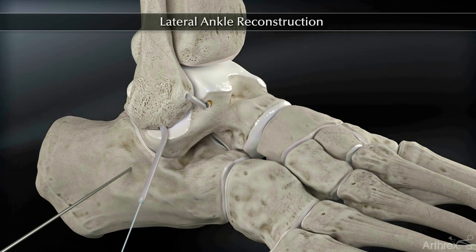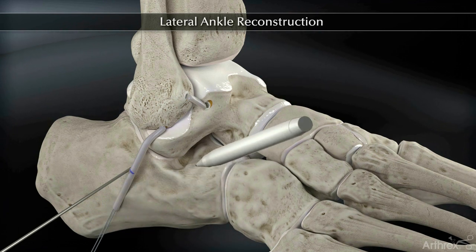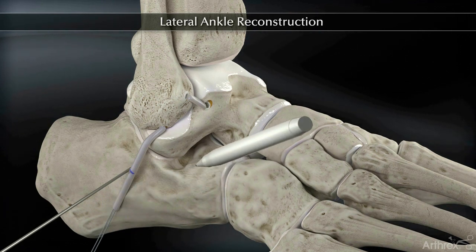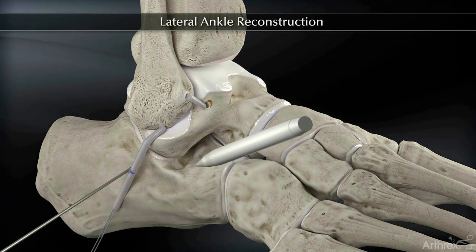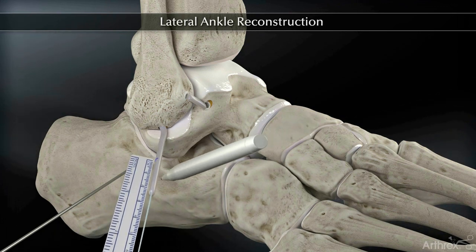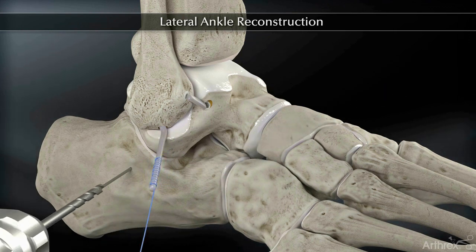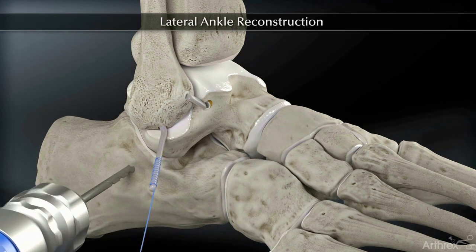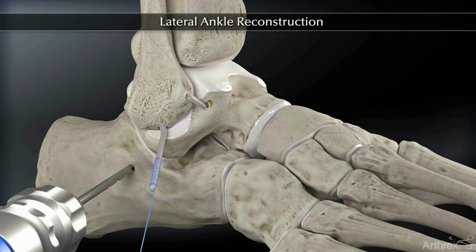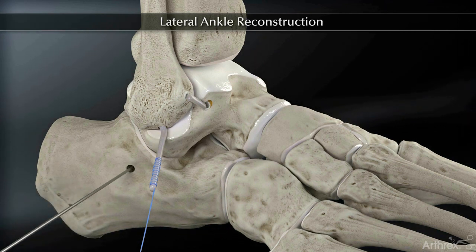Prior to drilling, note the insertion site of the tendon graft into the tunnel and mark the entry point with a marking pen. Measure a distance of 17 mm from the initial line, mark again, and cut any excess tendon. Finally, whip stitch the remaining portion of the tendon. Drill over the 2.4 mm guide wire with a 5.5 mm reamer to a depth of 17 mm and remove the reamer and guide wire.